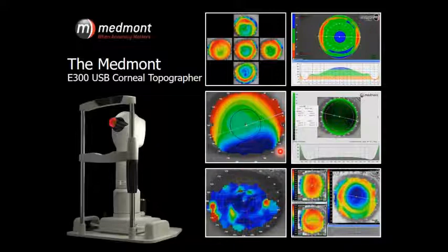And then as you notice the duration going on in seconds, the tear film continues to show its distorting or breaking up. So your reflection-based topographer doesn't have to just be a tool for measuring eye shape. It can also be a diagnostic tool for determining non-invasive tear film breakup time, as well as the overall quality of the tear across the entire surface area that's measured.